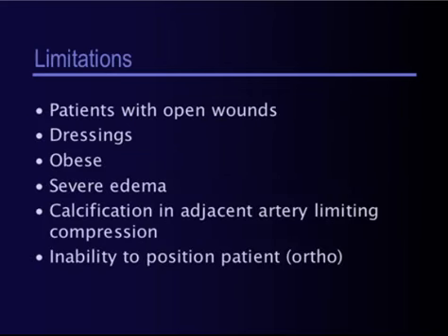Okay, and lastly, just want to point out some limitations to the examination. Patients with open wounds may sometimes not be open to you compressing their leg, and obviously we don't like to do that. When they have dressings, we may remove dressings, but there are a few complicated surgical dressings that we need to leave alone, and we may sometimes not be able to evaluate vessels that are deep to these dressings.